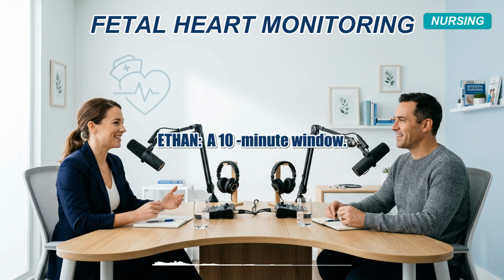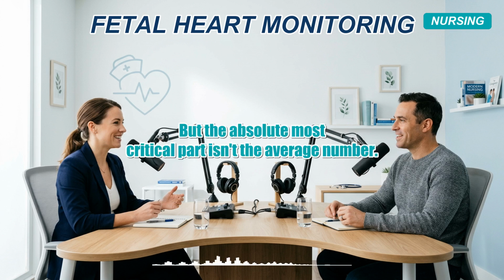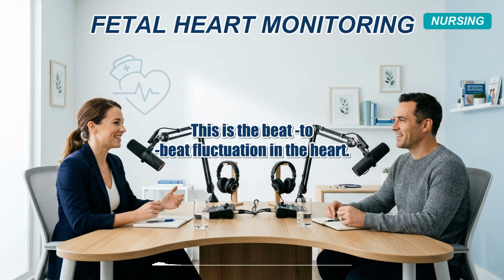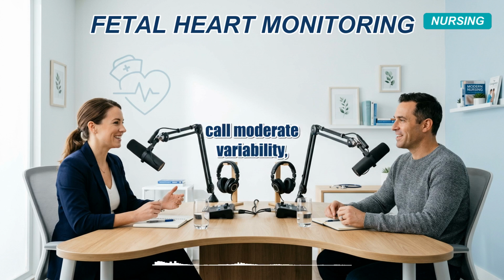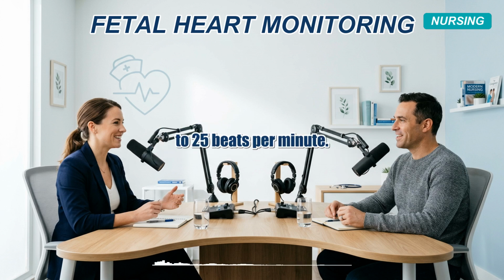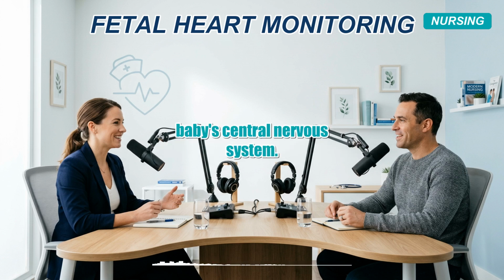Like a 10-minute window. A normal, healthy baseline averages between 110 and 160 beats per minute. But the absolute most critical part isn't the average number, it's the variability. Baseline variability. This is the beat-to-beat fluctuation in the heart. Yes, exactly. The sources outline that clinicians are looking for what they call moderate variability, which means the heart rate is constantly fluctuating by 6 to 25 beats per minute. And that constant fluctuation tells us a lot about the baby's central nervous system.